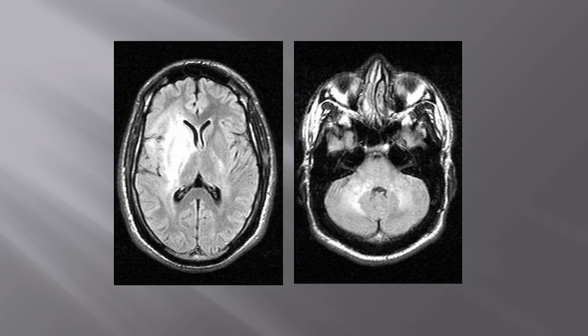Now this case is kind of interesting. You have this diffuse, quite a bit different appearance, kind of diffuse, infiltrating the more you look. Kind of see it here, maybe a little bit over here. See that here, a little T2 change even going into the posterior internal capsule. Have some mass effect. Septum is ever so slightly shifted to the left, even down in the cerebellar hemisphere, in the middle cerebellar peduncles, have a little T2 signal change.